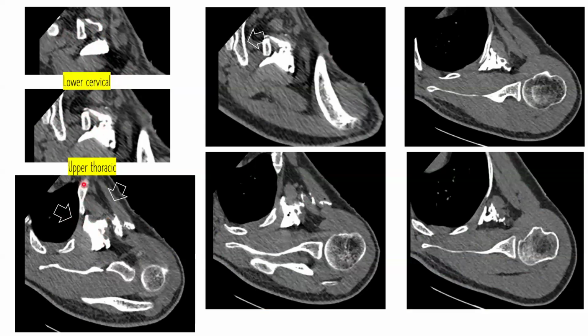You can see in the thoracic area, again, of course, this is the infraclavicular area, which is bounded by the pectoralis major. We can see this is the pectoralis major. This could be the serratus and the subscapularis. This is the spine of the scapula. So this is the subscapularis muscle, the serratus, the pectoralis major, and then caudally, it moves on into the axillary brachial plexus. So if you look at this again, it's exactly engulfing the artery. This hypoechoic shadow is the artery, and engulfing and around would be the brachial plexus.